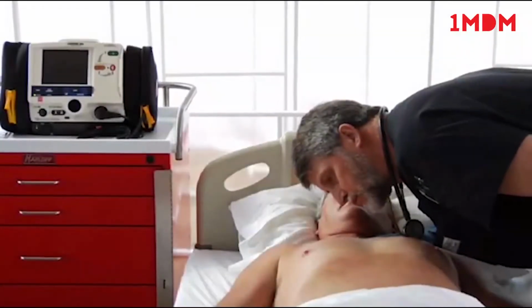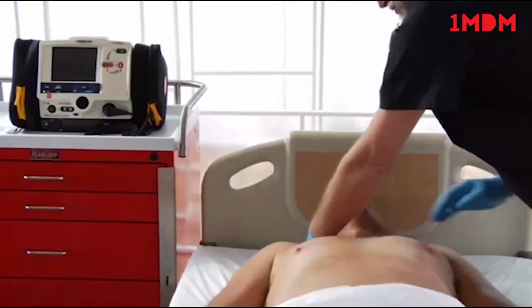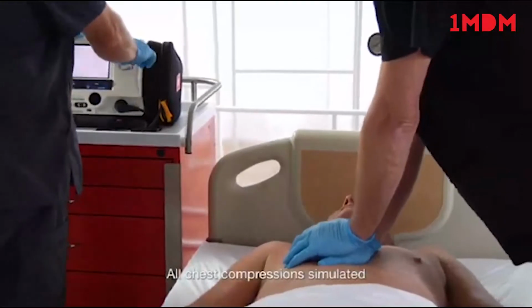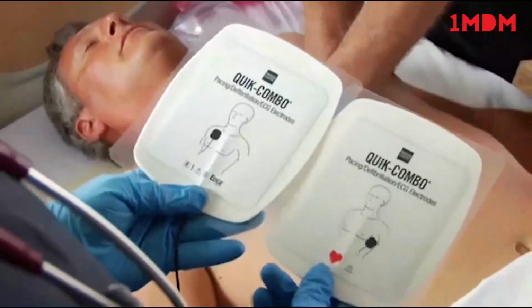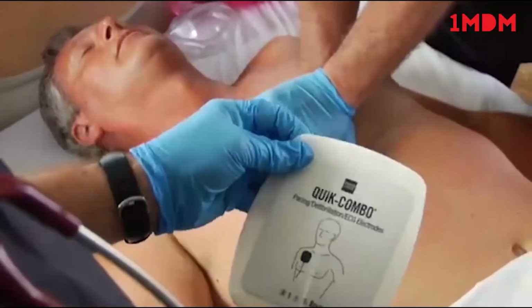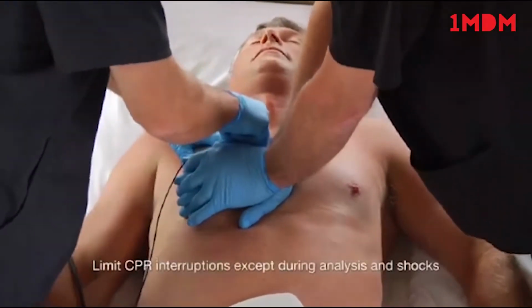So, let's begin. You have an unresponsive patient. Verify the patient is not breathing normally and has no pulse or other signs of circulation. Turn on the defibrillator. Bare the chest. Prep the skin if necessary. Place the electrodes in the anterior lateral position as shown in the picture on the back of the electrodes. Make sure the electrodes do not touch each other, lead wires, ECG electrodes, dressings, or medication patches.